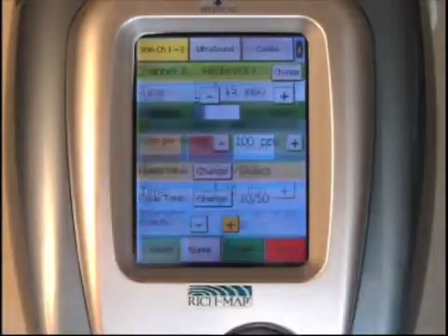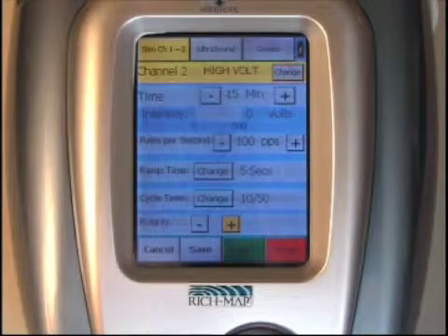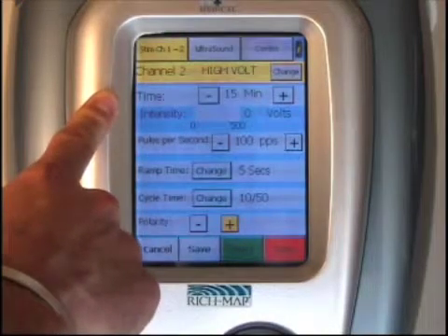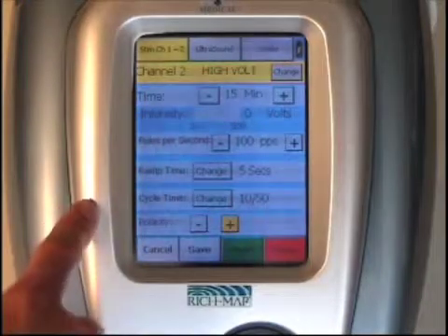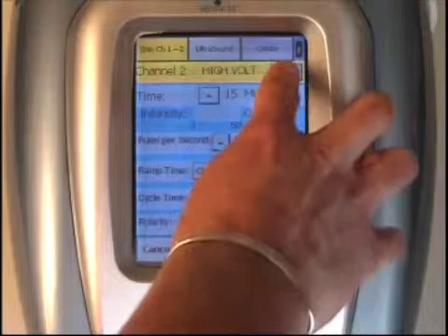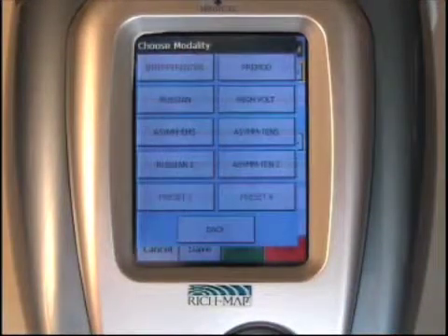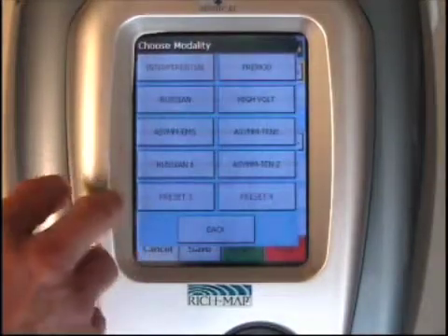Repeat the same sequence you did on channel one by pressing detail. At that point, you're able to select the modality of your choice. If high volt is selected, you simply press start, or select the treatment parameters you want to adjust, or push the change button at the top of the menu and select any of the six modalities of your choice.